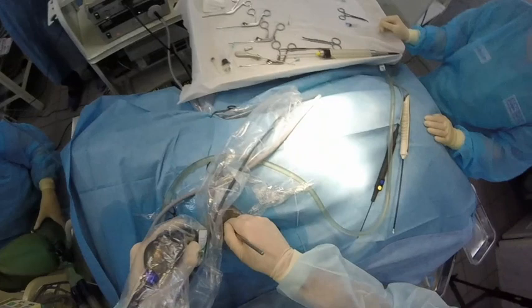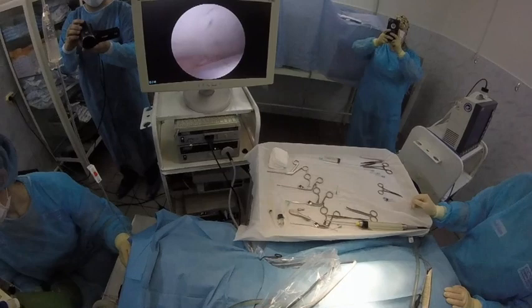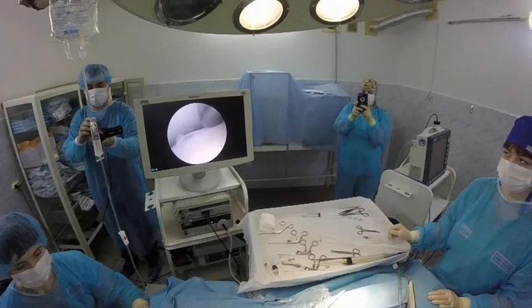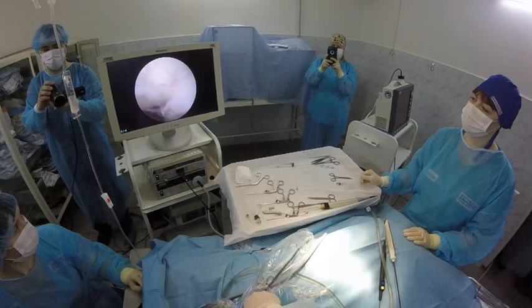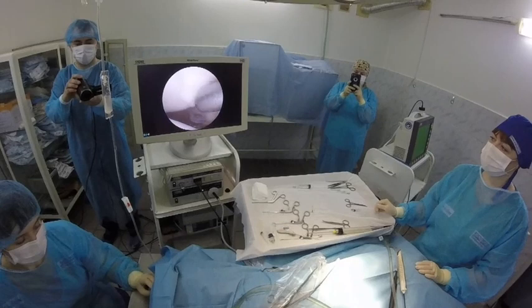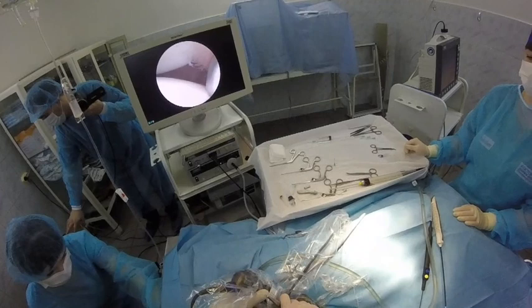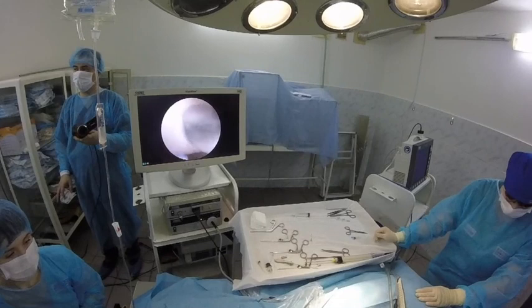Give me outside picture please. As you see, I try to check this problem. I think there is some problem in the caudal part of the glenoid, and I try to check it. Give me inside picture please. As you see, I find some problem in the caudal part of the glenoid. Yes, this is very strange.